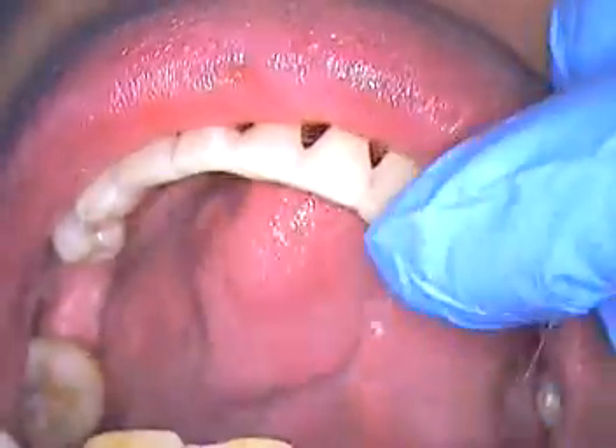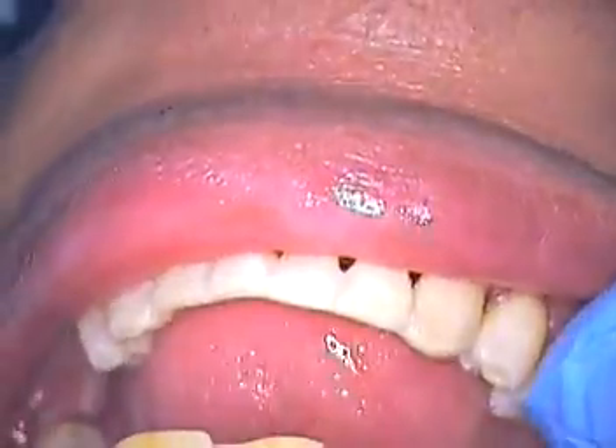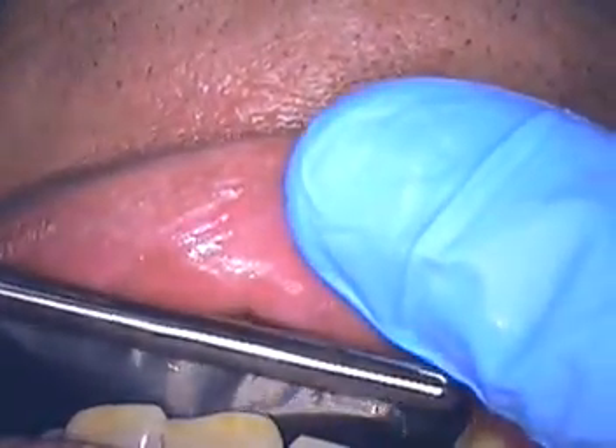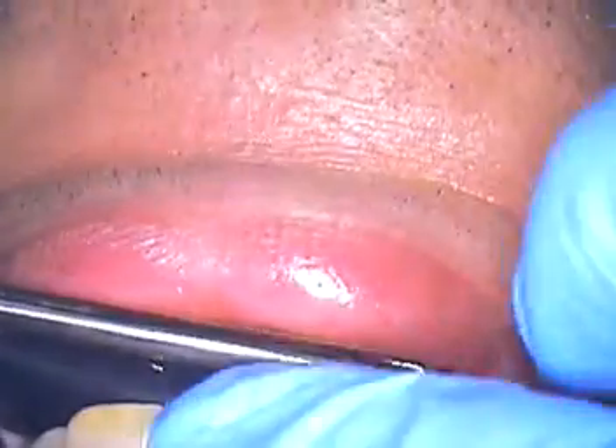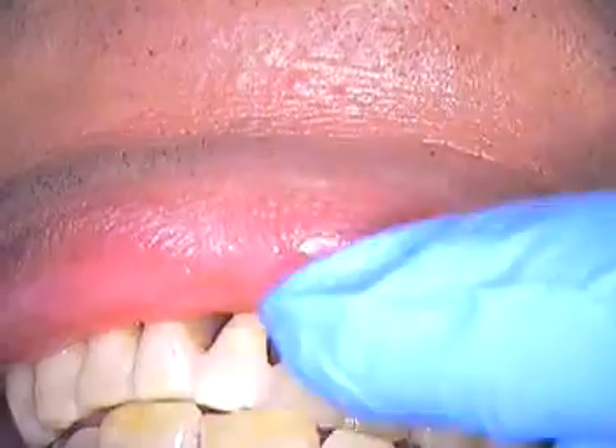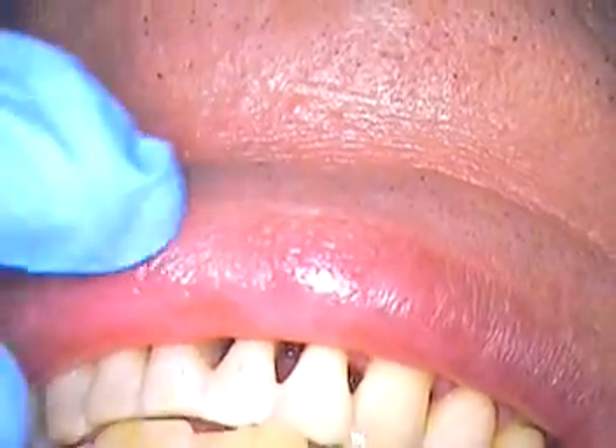You okay underneath? Now we're going to check his bite. So articulating paper ready. We'll do just a light adjustment — I'm going to see him in a week. Go ahead and close down together, grind around on your front teeth, back teeth, all the way. Touch my finger way out here in the front. So I see he's hitting it just a hair, so we're going to take it down.